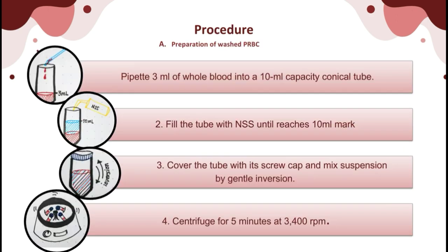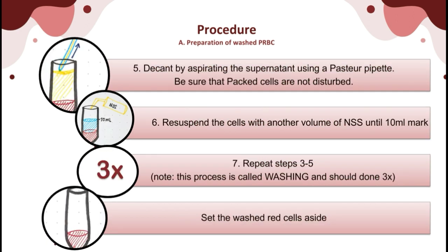For the procedure, pipette 3 ml of whole blood into a 10 ml conical tube, then fill the tube with NSS up to the 10 ml calibration mark. Cover the tube with its screw cap and make a suspension by gentle inversion; for plain test tubes, use Nesco film to cover the mouth. Centrifuge for 5 minutes at 3,400 rpm. Decant by aspirating the supernatant using a Pasteur pipette, being sure the packed red cells are not disturbed. Resuspend the cells with another volume of NSS to the 10 ml mark. Repeat this process 3 times — this constitutes red cell washing. Set the washed red cells aside.